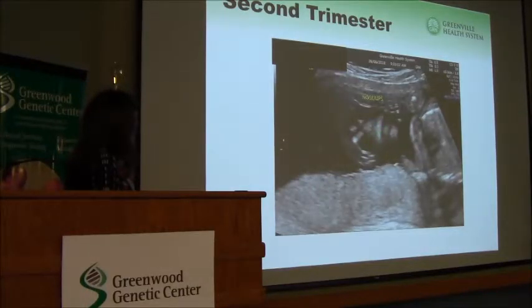Right here is the upper lip, the philtrum. You can see intact there. Try to get this image in every child. Obviously, you mentioned that this was one of the more common birth defects. We're pretty good with cleft lip, not as good with just isolated cleft palates, particularly if it's a soft palate, although we do have the capability to look in families that have that history because it tends to be familial.